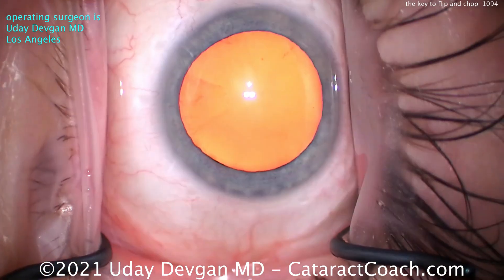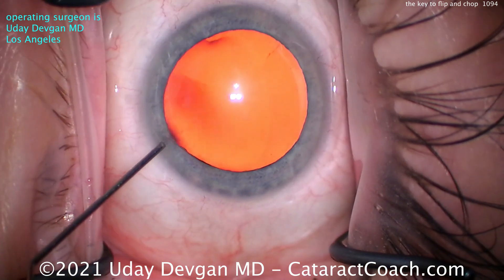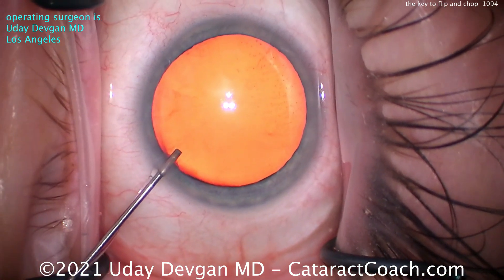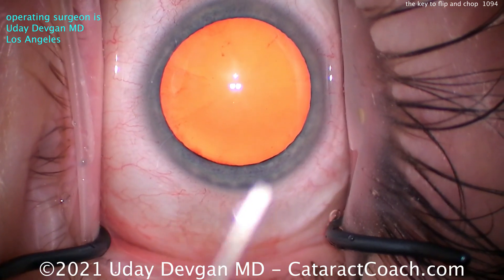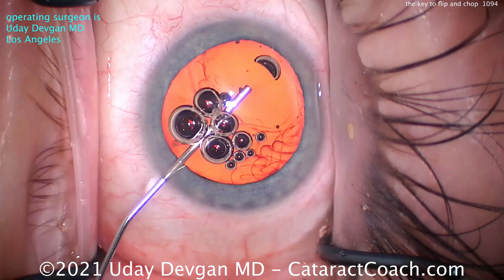This is a complete cataract case. I'm going to show you my whole surgery from start to finish. For those of you who just can't sit through the beginning part of the surgery, go ahead and watch a different video. If you can't put up with five minutes to watch this surgery, you found the wrong channel.